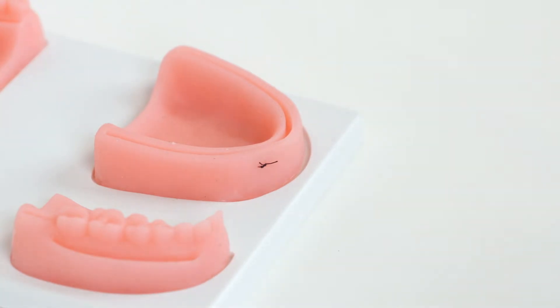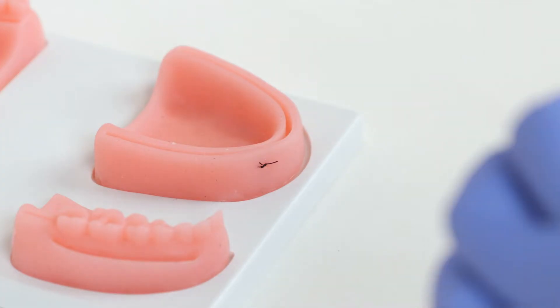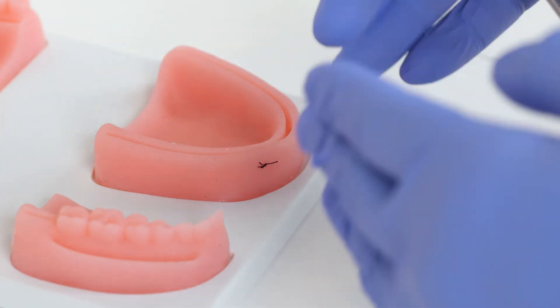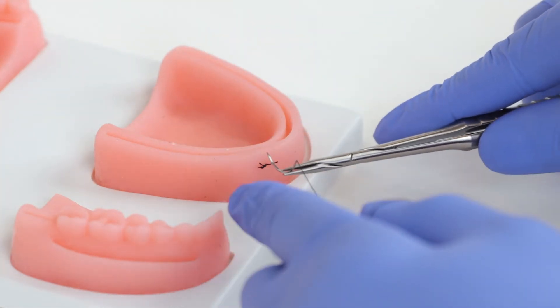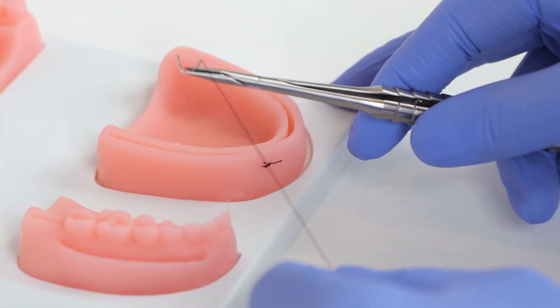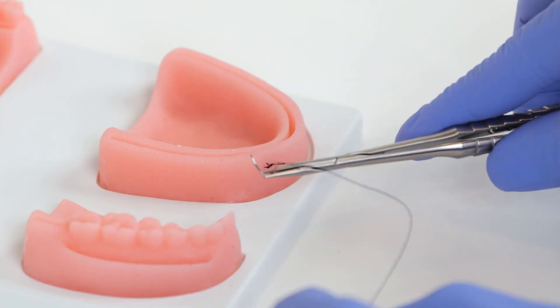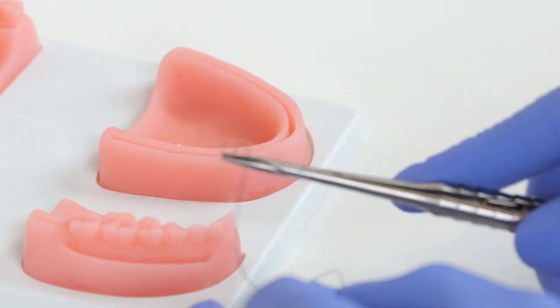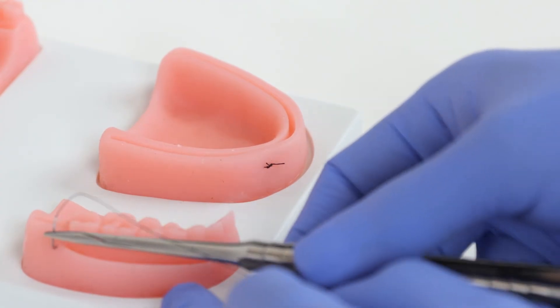In areas where we're concerned about blood supply being choked — say a delicate area like a papilla that you want to bring together without too much tension — we can modify the approach. Instead of a horizontal mattress, we can do a vertical mattress. In that case, instead of a distal pass and then a mesial pass, we're going to have an apical pass and a more coronal pass through the tissues. Here's our apical pass coming through.